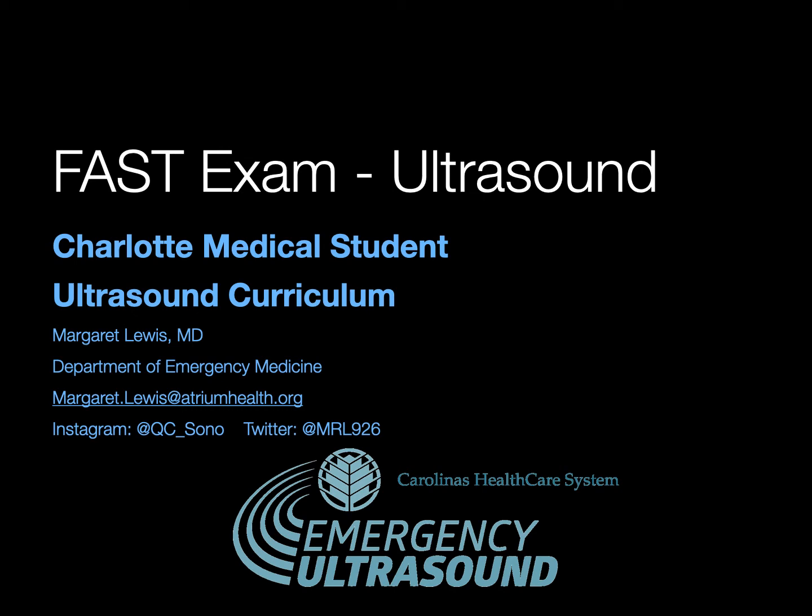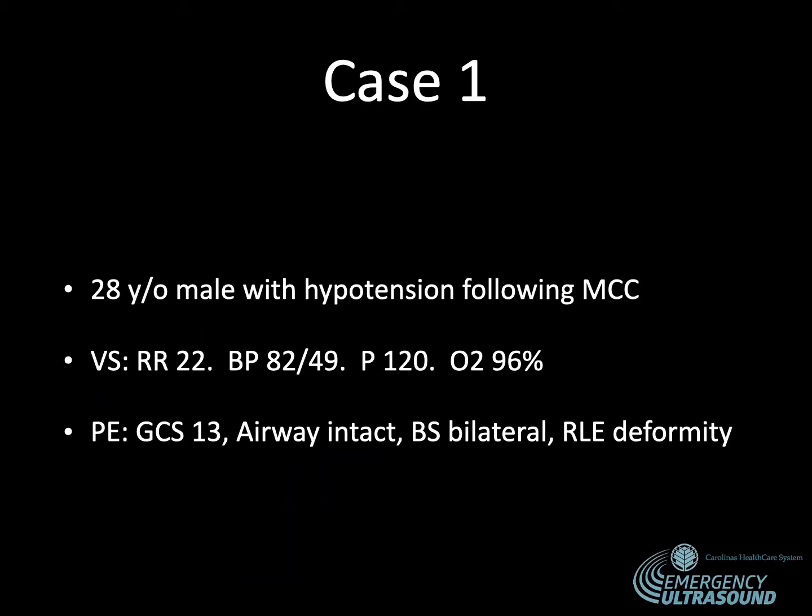Hey team, so today we're going to talk about the FAST exam, the point of care ultrasound exam that you will come to know and love. I know that some of you have already had experience performing the FAST and learning a little bit about it, but we are going to talk about it a little more in depth today. First, we're going to start with a couple of cases.